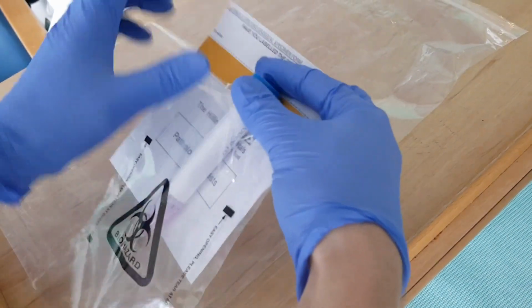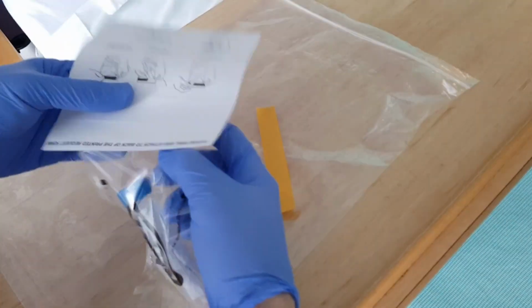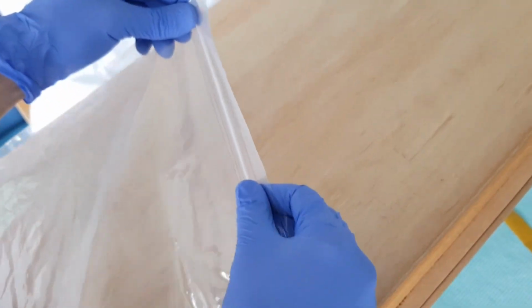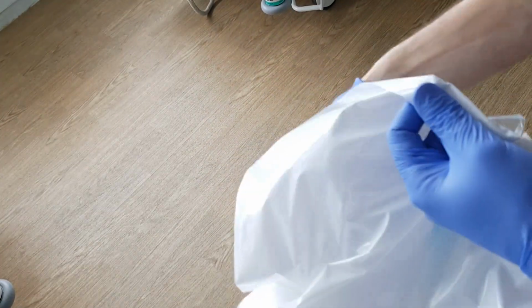Place the tube in the pathology specimen bag and then the resealable bag and close. Place the bag and one of the copies of the request inside the white bag and close.